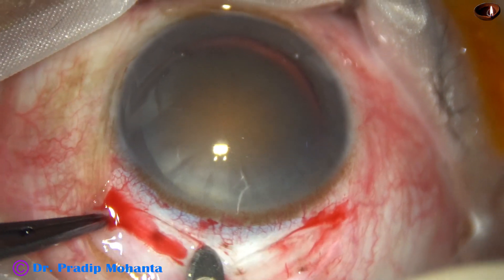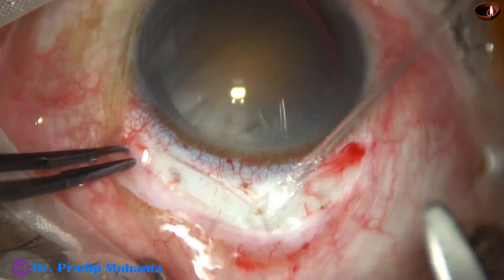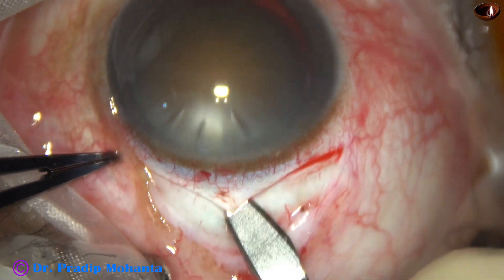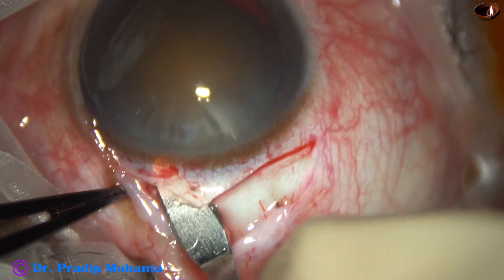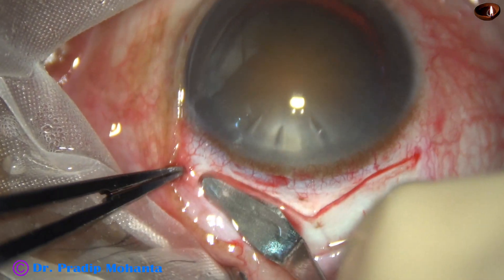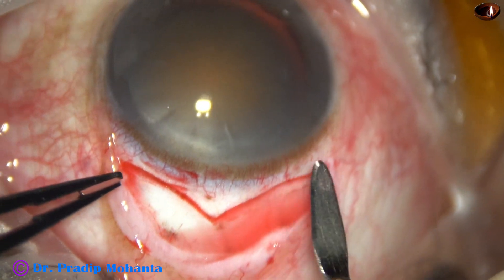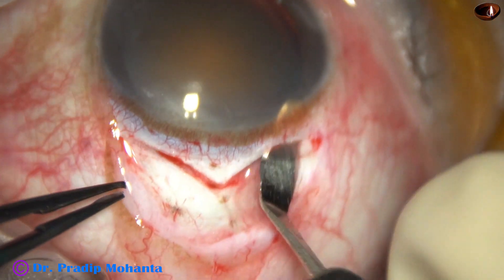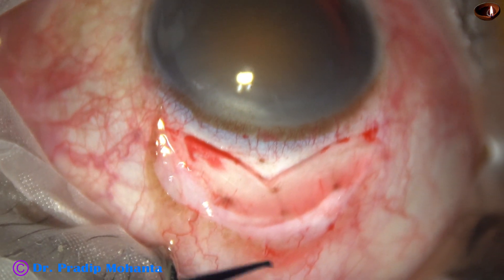It's a large incision and it is a very safe technique for very hard cataracts. This is the right depth all around, from one side to the other side, and then making the sclerocorneal tunnel. Two SICS wounds adjacent to each other gives the V-shaped appearance of the wound. As we do the sclerocorneal tunnel in SICS, the same way the sclerocorneal tunnel is done. When going to the right or left side, the contour of the eyeball must be kept in mind and the crescent blade has to be tilted accordingly.